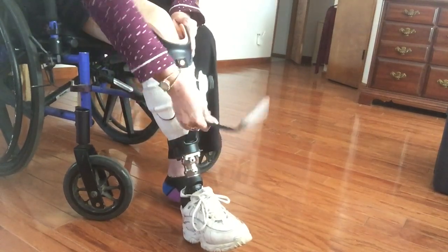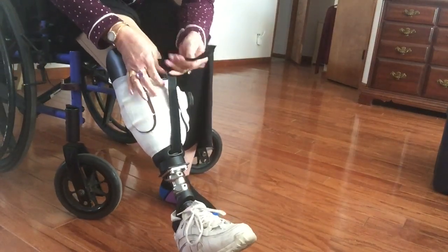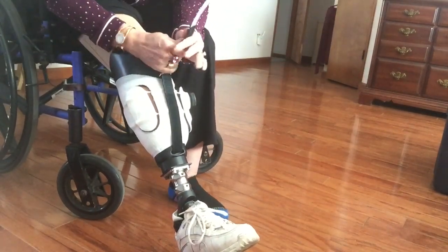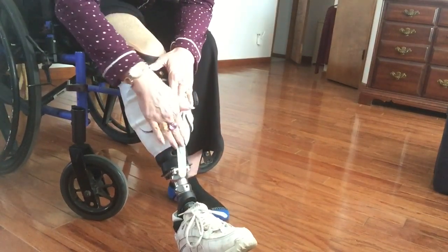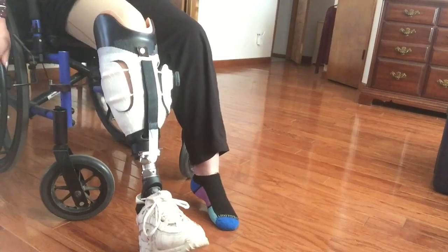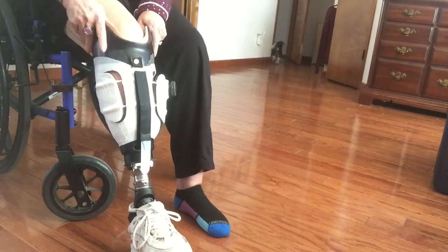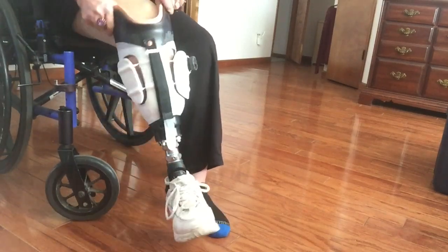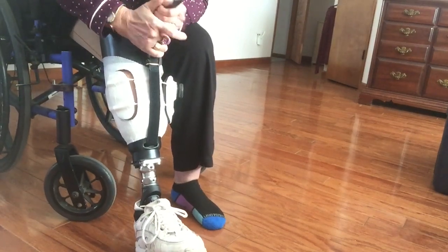It pulls my leg in real tight. The first prototype was just the strap and it was turning on me up to 90 degrees, which was very unsafe. I had a really miserable 48 hours trying to work with it — falling, scary, all of that. It kept turning and twisting like that — really scary.